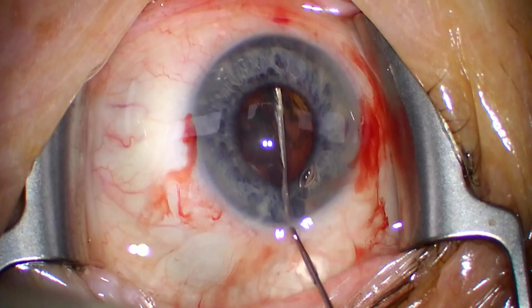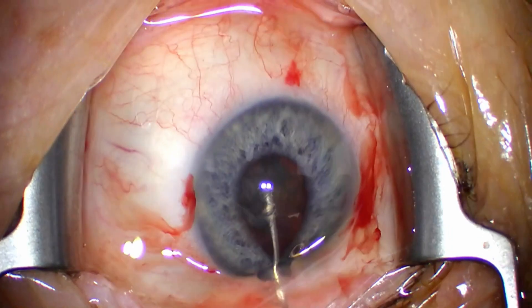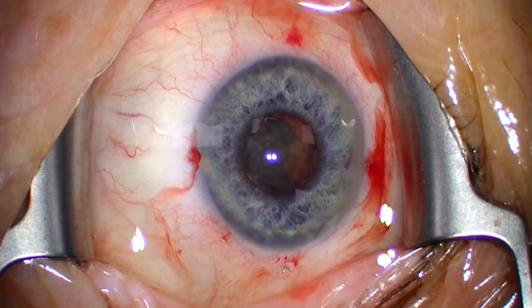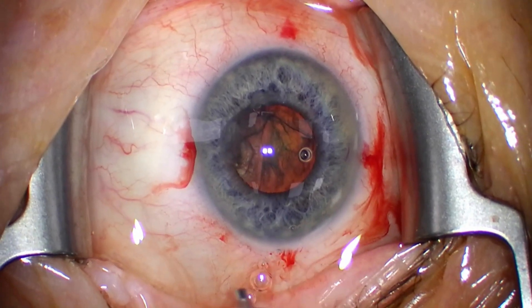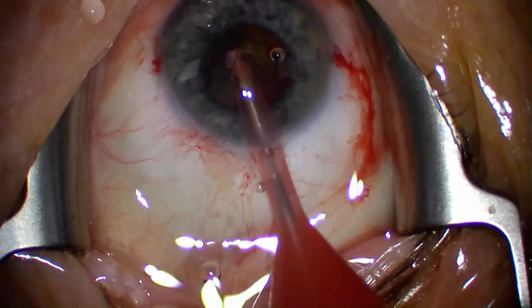What you want to do is change the pressure gradient. Outside the eye pressure is atmospheric; inside it's higher. So you want to lower the pressure inside the eye and behind the iris. First, push on that lens to release all that BSS behind it, then also release some of the viscoelastic. When you do that, the iris goes back in without anything. Now I'm refilling the area in front of the wound with viscoelastic — otherwise you can get another iris prolapse when you enter with the phaco probe and create an iris defect.